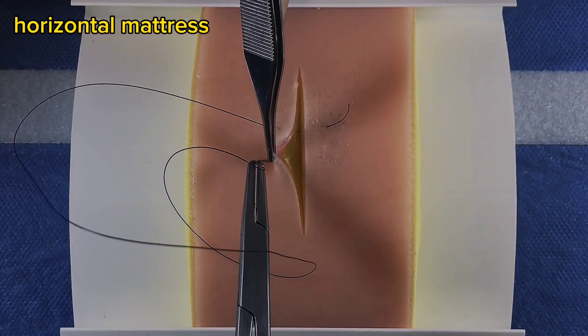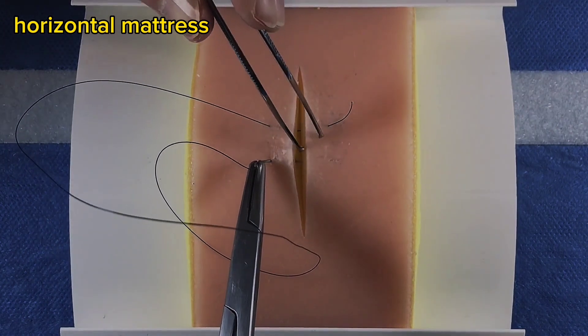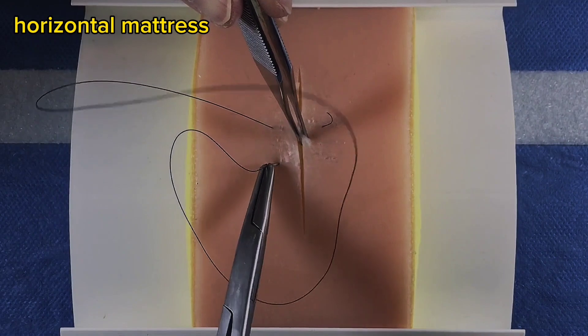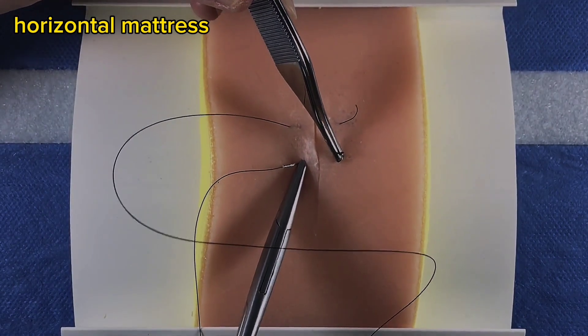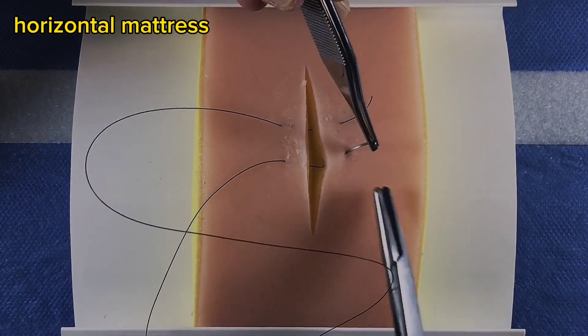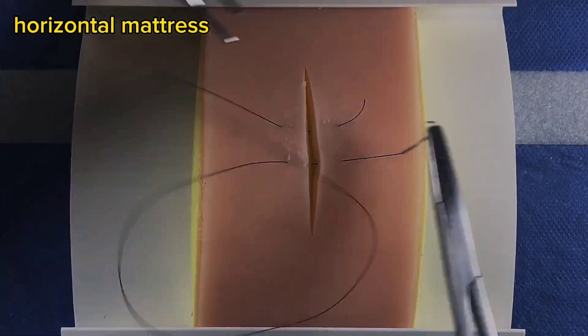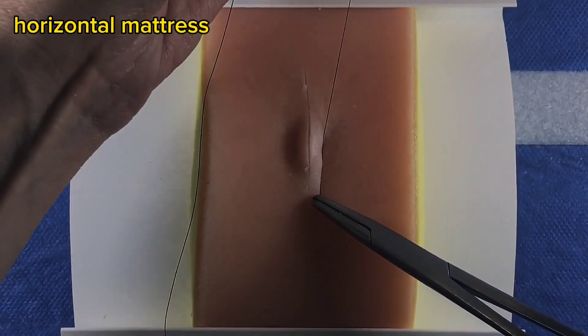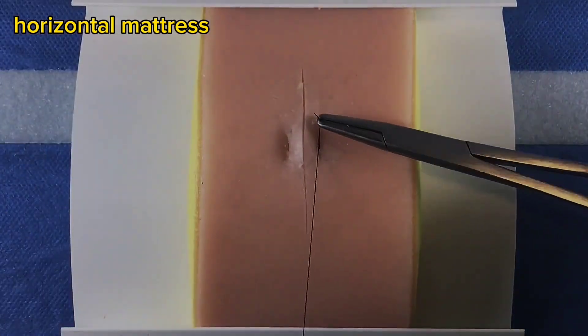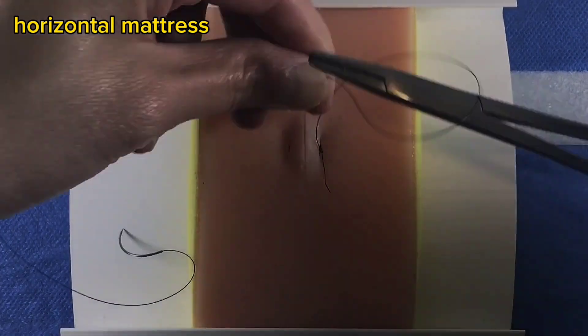Advance a distance of about one centimeter away from where the needle exited. At the same distance away from the wound edge and at the same depth as the first bite, drive the needle across back to the other side. Tie the suture strands together and cut.